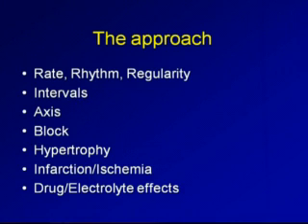And it will also contain graphic examples of some of the stuff that we'll talk about, so you can refer to that if you need to. To begin with, when reading an EKG, you really have to have a systematic approach to it. If you just grab an EKG, lay it in front of you, and hope that the major abnormalities will jump off the page at you, you're going to miss most of the information that's available to you on an EKG.